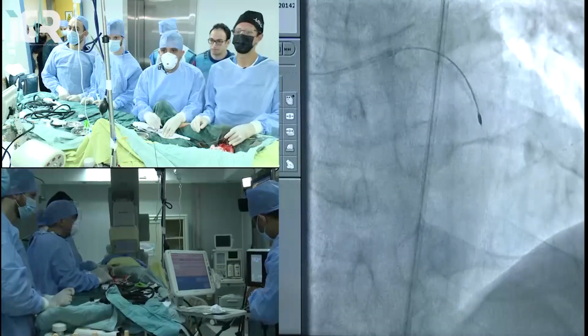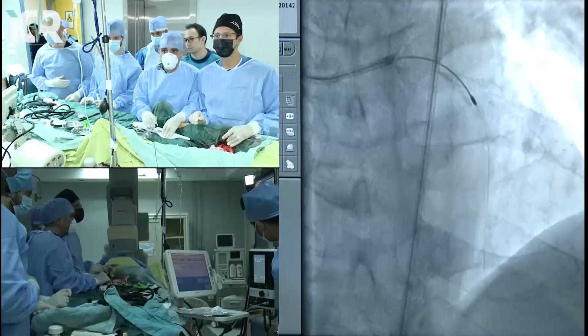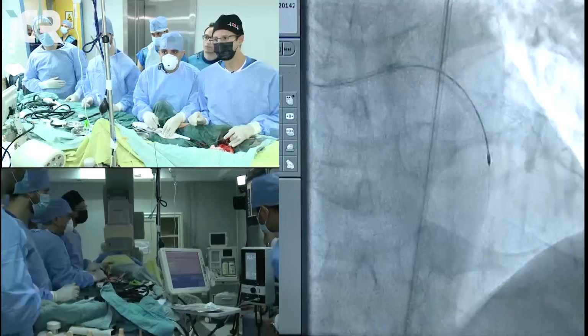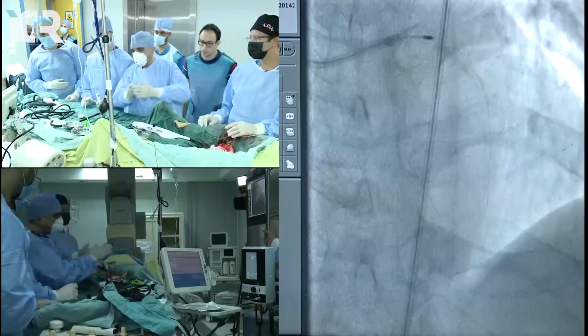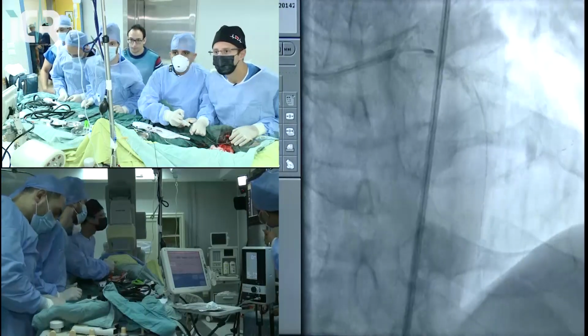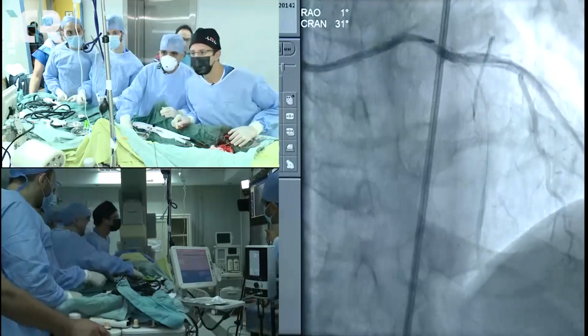Okay, pause now. So now it starts smoothly. Higher speed now, used for passage of the burr. Check. You can do polishing at lower speed than 1.5. So now we have a lumen. It's okay.